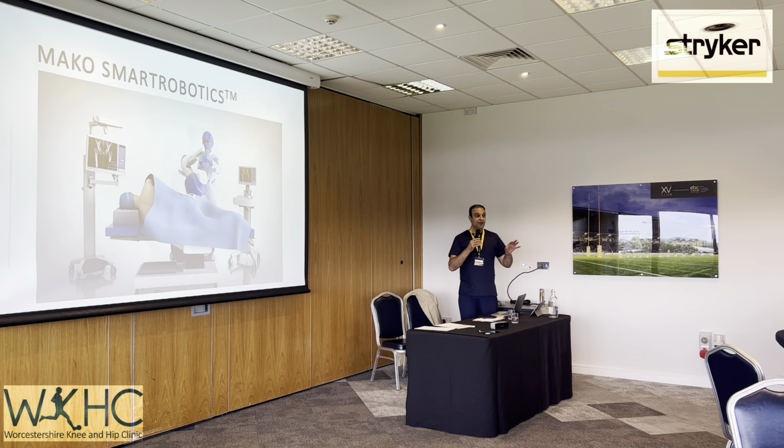Positioning of the robot is something that you will develop and you will learn as you go through. When we started, we used the textbook positioning. The problem with the textbook positioning is that the camera falls in the same position as where the anaesthetist is. Now, if you've got an anaesthetist who's not in theatre wandering around, then you're all right. But if you've got an anaesthetist who wants to sit down and read the paper, then you've got to make sure that the camera system is put in a separate position.